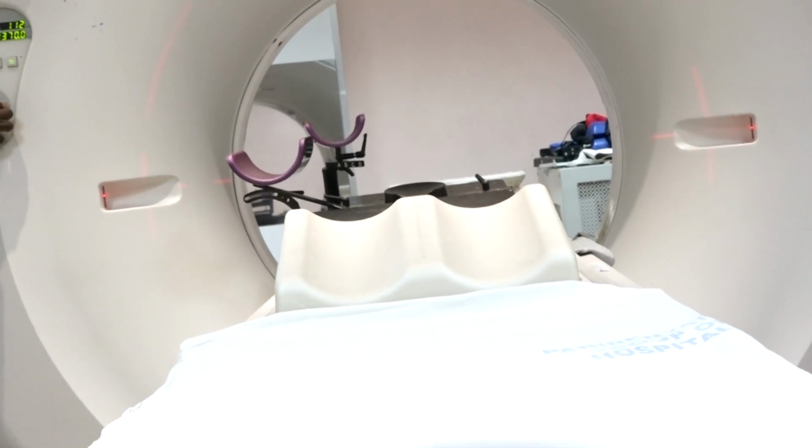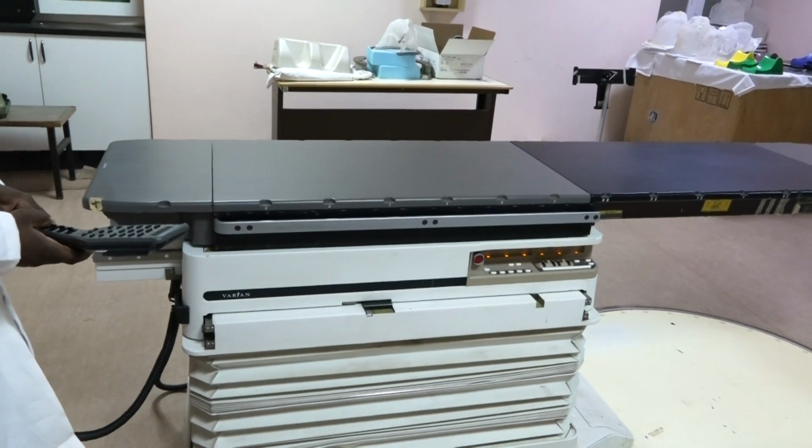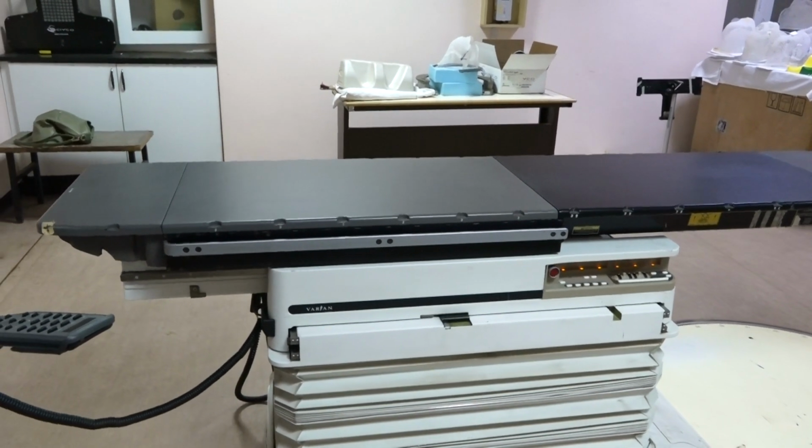As you know, when we're giving radiotherapy, the X-rays pass through the body to reach the area that we want to treat. And in that process, the X-rays pass through some normal structures that have nothing to do with the cancer. So we want to map out the normal structures that are close to the cancer but that we can't avoid. The reason we do all of this is so that we can calculate the dose that the area affected by the cancer is getting, and also how much these normal organs that are not affected by the cancer are getting, because we do not want to give more radiation to the normal organs than they can handle. So we need to track that and calculate it before we give the treatment.